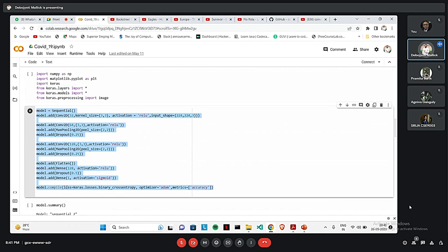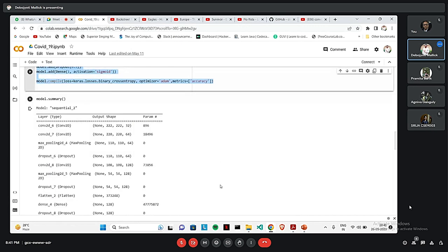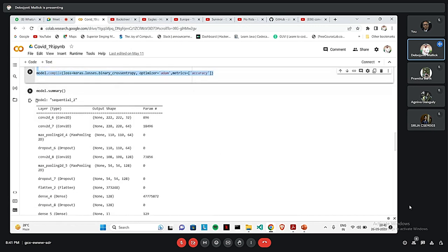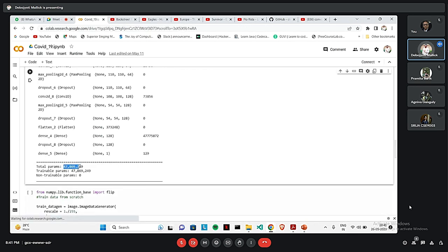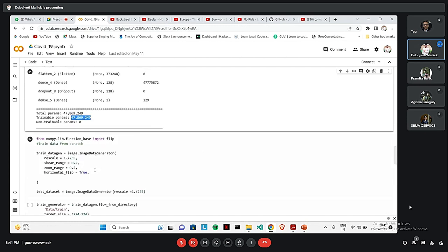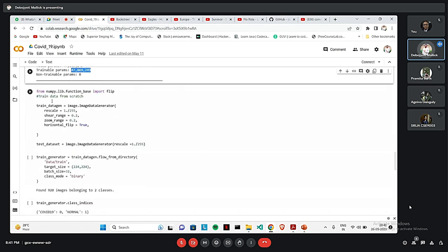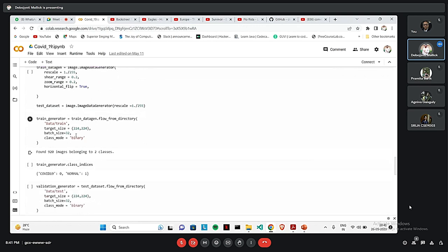For model compile, we have compiled this into the binary classification. For doing the binary classification, to optimize it, we have used Adam and metrics for accuracy. The model summary is given over here. The total parameters that we have used is given over here. And all of them are trainable parameters. Here we have just coded how the image data generator function will work for the rescale, the shear, the zoom range and everything.